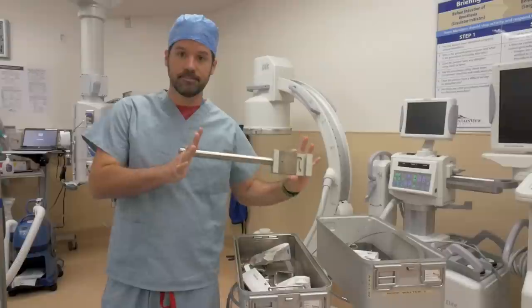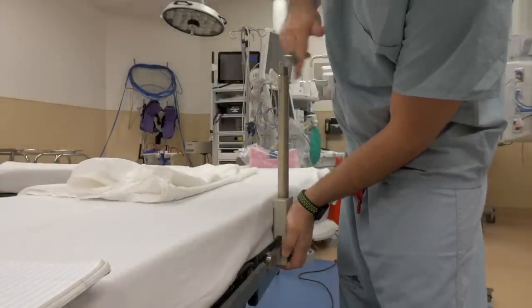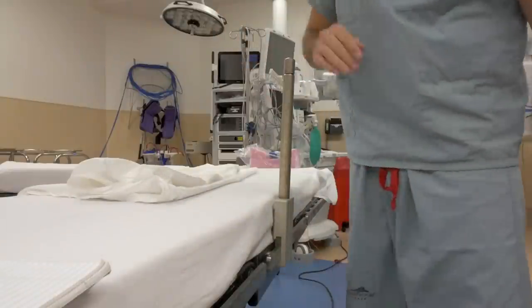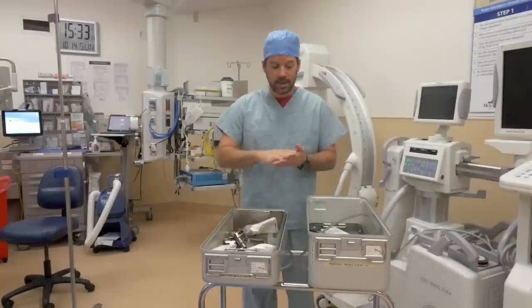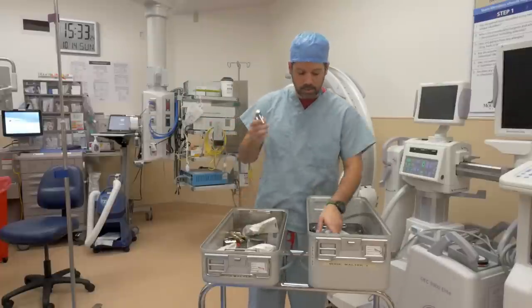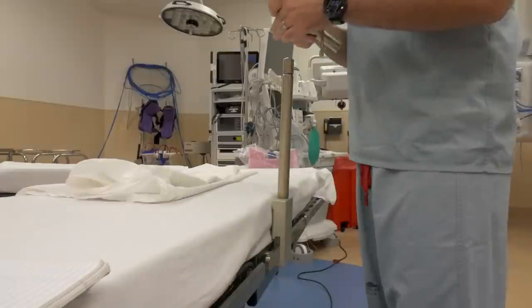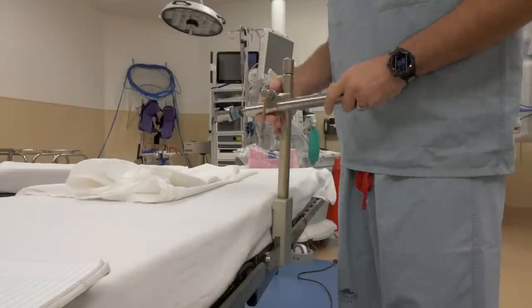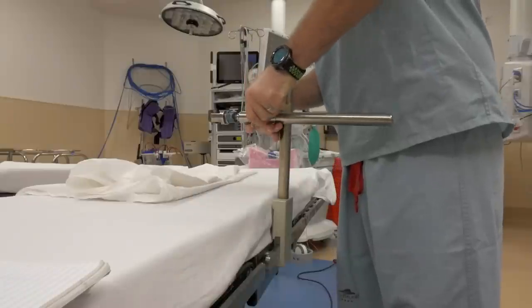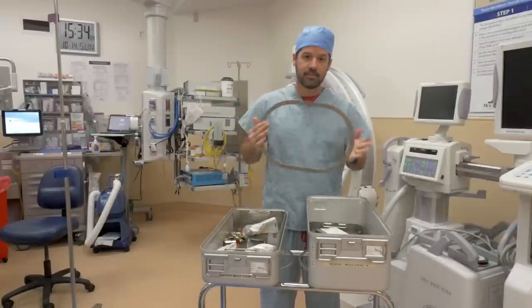First things first, the table mount. Now that the table bar is on, we're going to need a crossbar that comes out over the patient's belly and attaches the ring that goes around the abdomen of the patient. So we will be using this big clamp with the crossbar. Now that the crossbar is installed, it's time for our ring to go over the patient's abdomen.